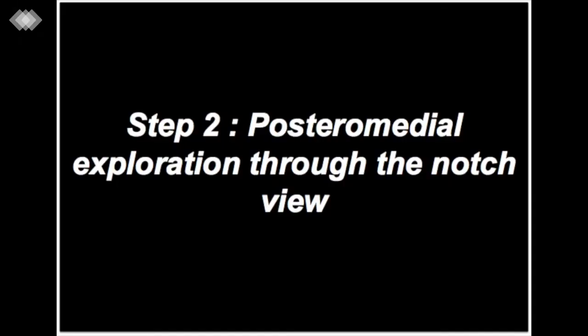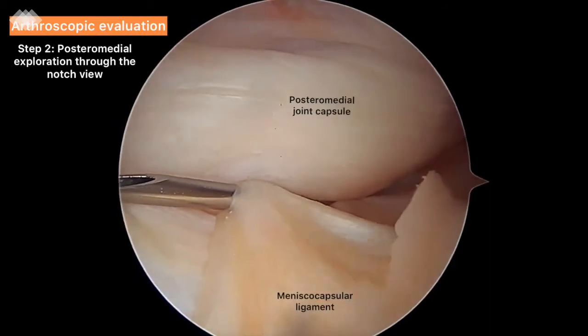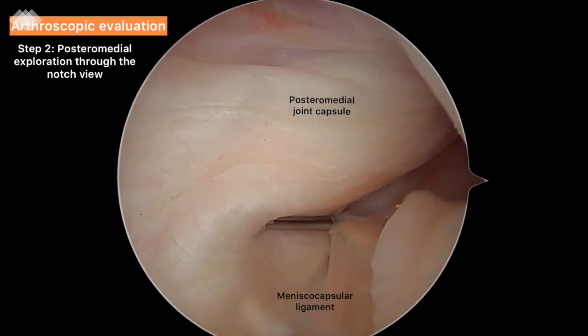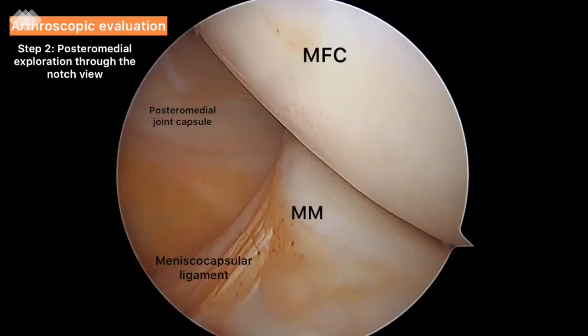Step 2: Posterior medial exploration through the notch view. The arthroscope is advanced through the intercondylar notch along the medial femoral condyle under the posterior cruciate ligament. The knee is now flexed to a 90-degree position. When inserting the arthroscope is difficult, we use a blunt trocar to prevent any damage to the optic. A needle is inserted into the posterior medial compartment to unfold the synovial membrane and thus define the lesion, ensuring the integrity of the meniscal capsular tissues. The meniscal capsular ligament is still attached to the posterior horn of the medial meniscus.